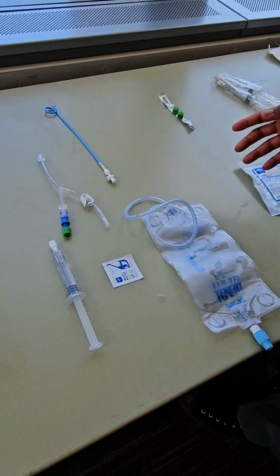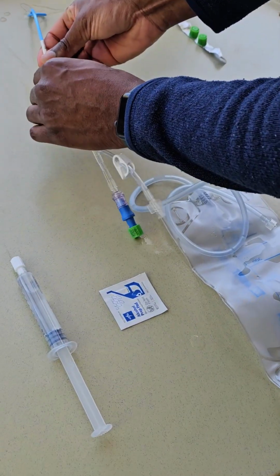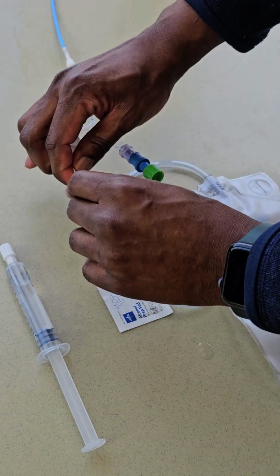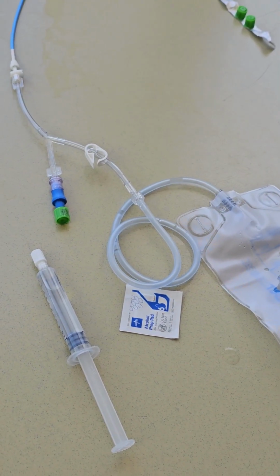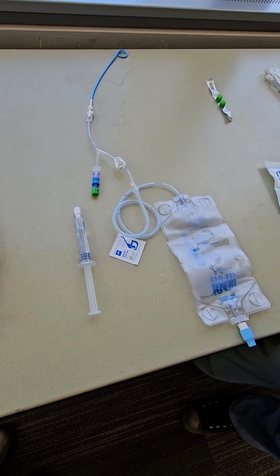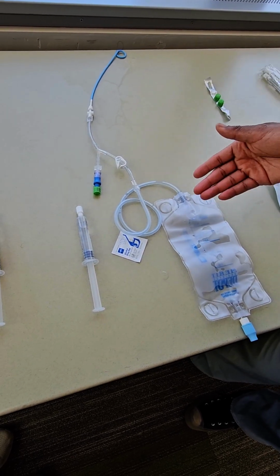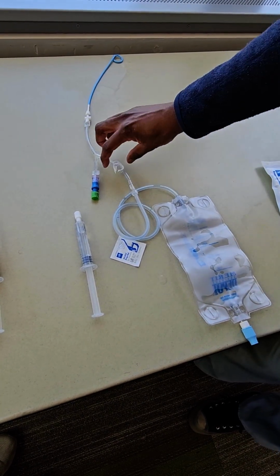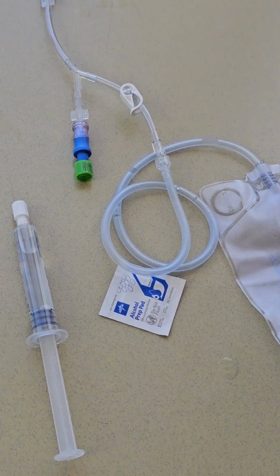So how is all this connected? Essentially, when the patient leaves the interventional radiology suite, we will connect the Y connector to the drain, and we will also then connect the bag to the portion of the Y connector that has the white clamp on it. So this is your standard system, and this is how the patient should present to you when they come in. The way the Y connector system works is via path of least resistance. So as long as this clamp is open, the fluid will naturally drain into the bag. If we close this clamp, the fluid will not drain into the bag, but it also helps us in terms of how we flush the system.